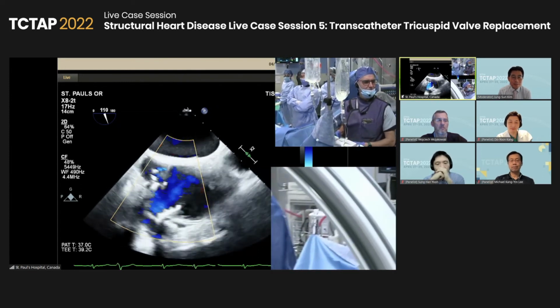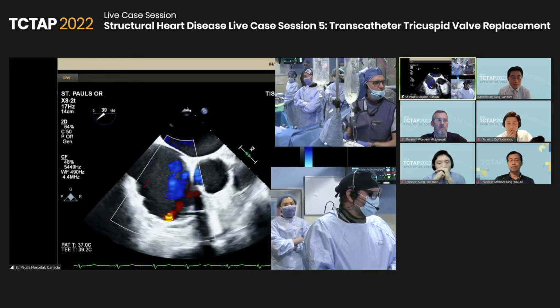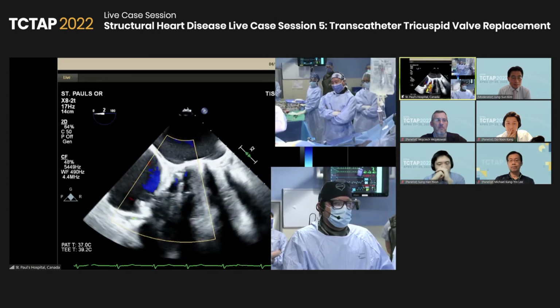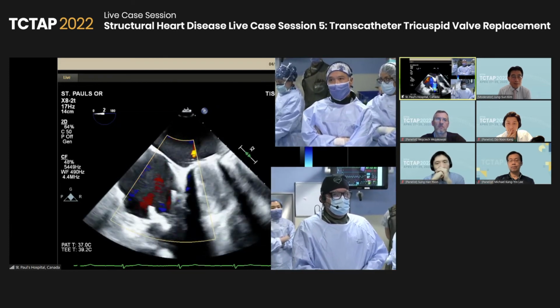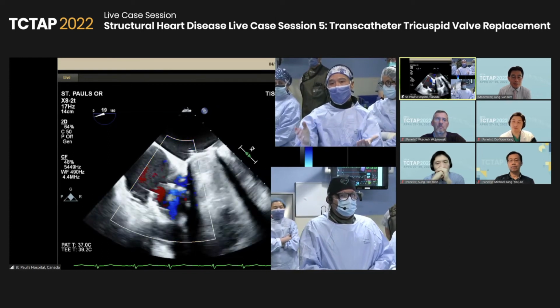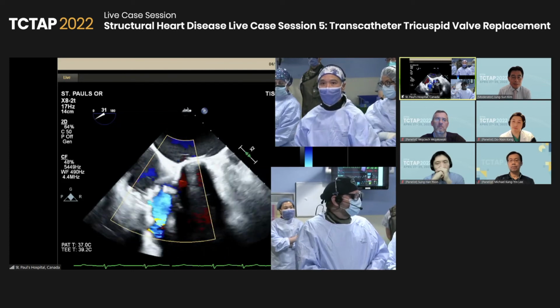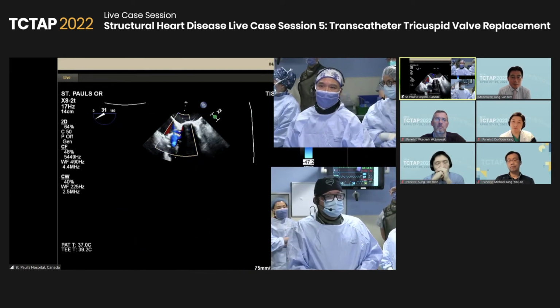And so this device has been implanted via a transthoracic route for the right atrium, which we have also done here in Vancouver. But the majority of those cases were done in China. So we have been noticing, with follow-up echo on those patients, once the endothelium grows around the skirt, those perivalvular leaks usually slowly disappear. So we are really not concerned about that at all.